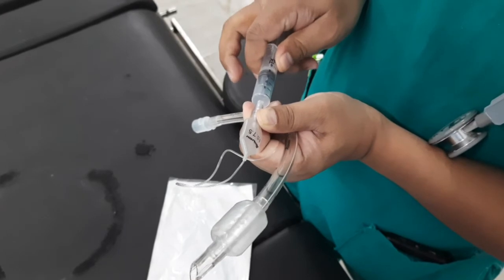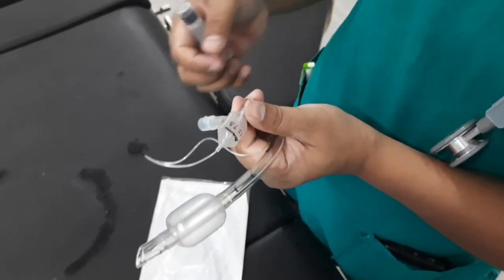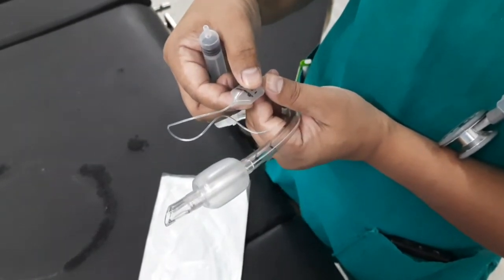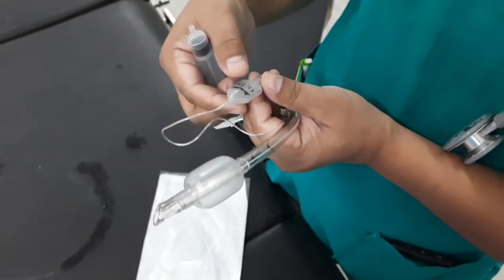By filling the pilot balloon, one can estimate the amount of pressure in the cuff. If the cuff is leaking — for example, due to damage by the surgeon during a thyroidectomy — the pilot balloon will collapse.